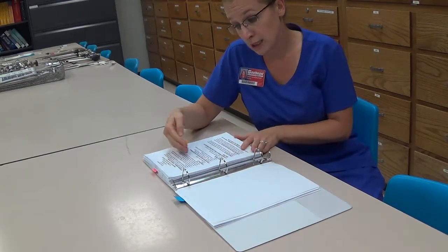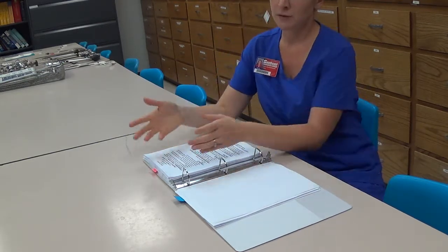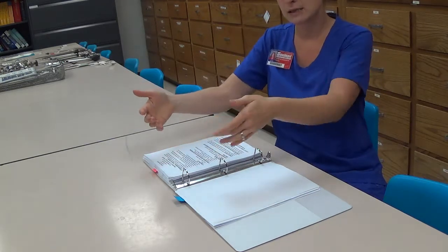So you'll really want to talk about asepsis associated with draping, making sure that the students understand about cuffing the hands so they're not contaminated, making sure they understand what's sterile about a drape, that it's only sterile to table level, talking about not dropping a drape to the floor and then picking it back up and extending it up to anesthesia. And then also just talking about when we drape things, if we're sterile, we always drape what's in front of us first, what's away from us last.